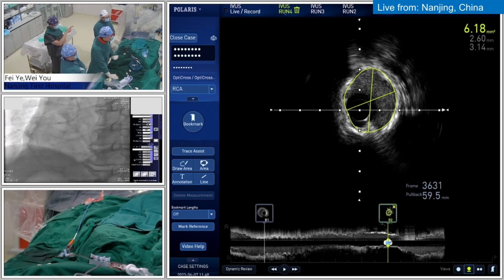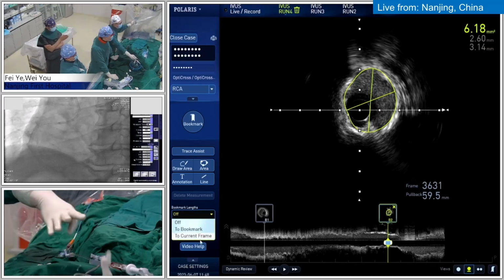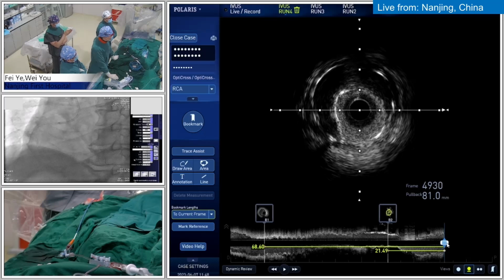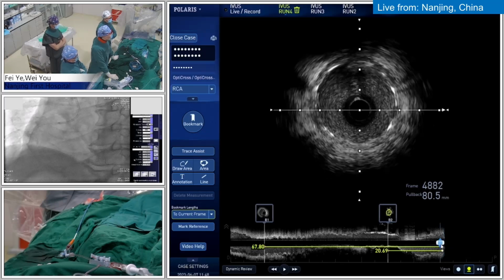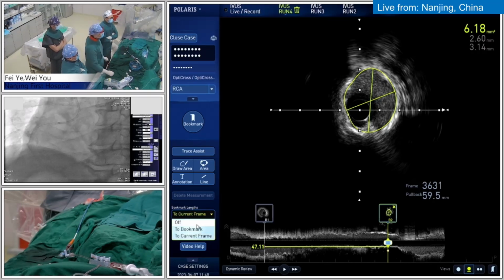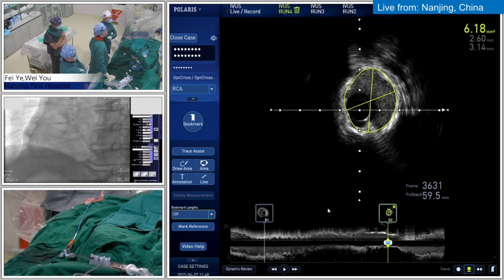So where, from the angiogram? Just in the heavily calcified site. Yeah, the proximal about 22 millimeter. Okay, still high pressure balloon post dilation there. Even if there is still under-expansion, we can bear to use it. Yes, maybe. That's a question.